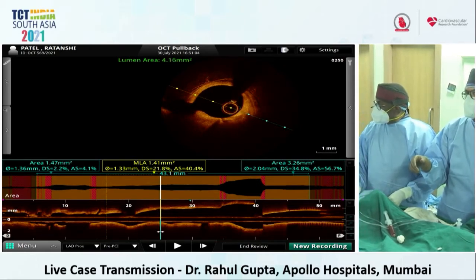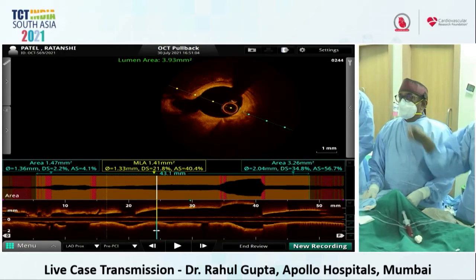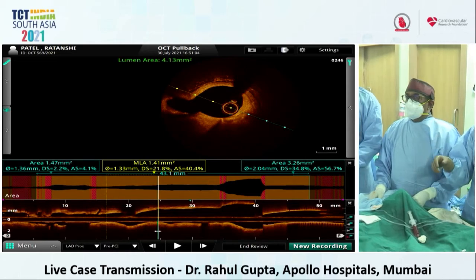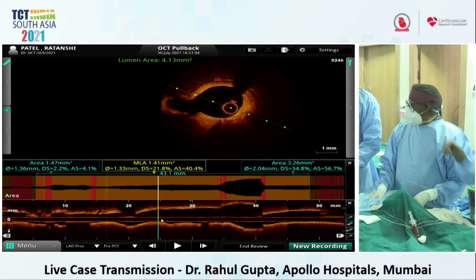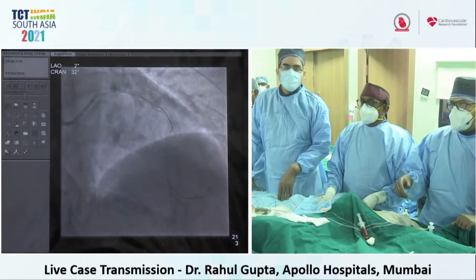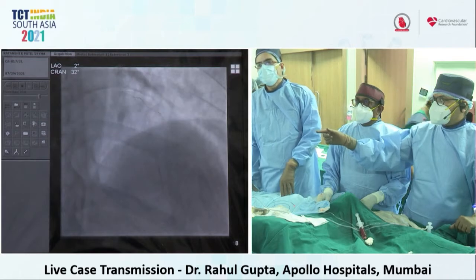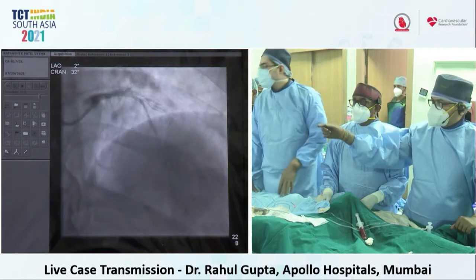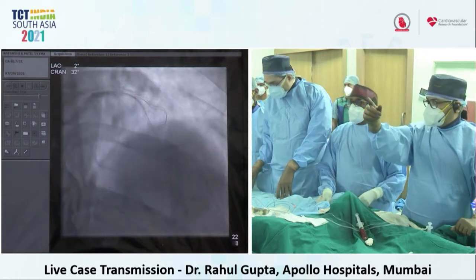That to save the contrast, if you have not taken a picture while taking OCT. Yeah, we have the picture of the angio which are there. Any one, and then show this. Okay. So can you show the angio pictures? We can just show you. Before OCT also, while doing it, you get an angio picture. Yeah, so the plan is to see where to start the stent and where to end. Can you show the angio pictures, go to the angio.